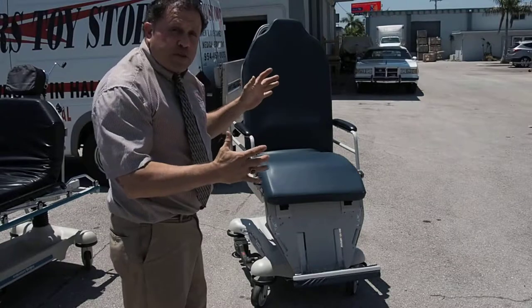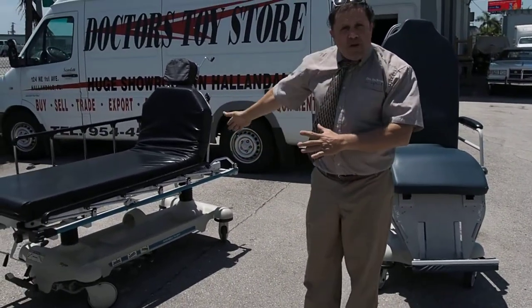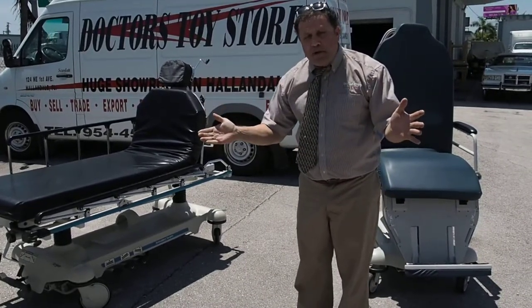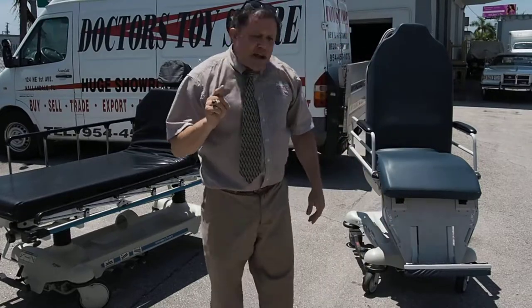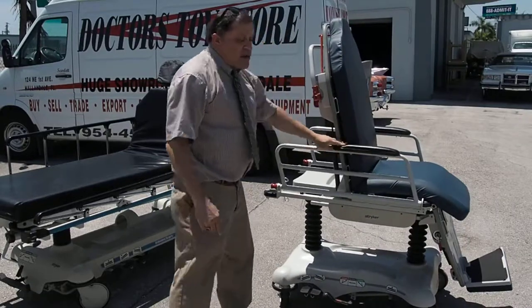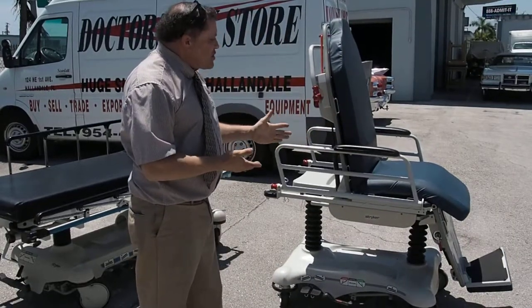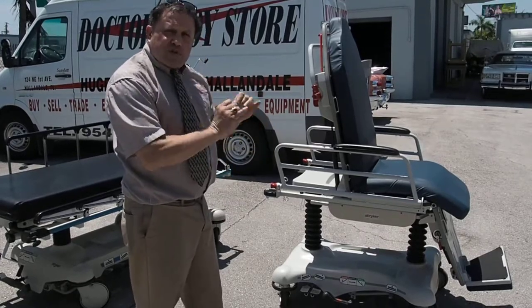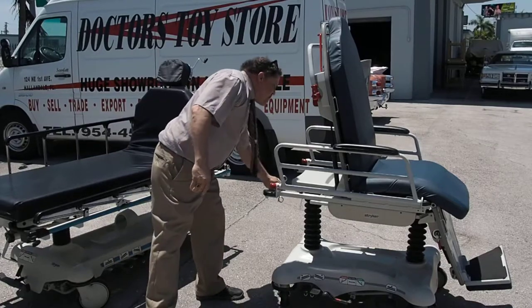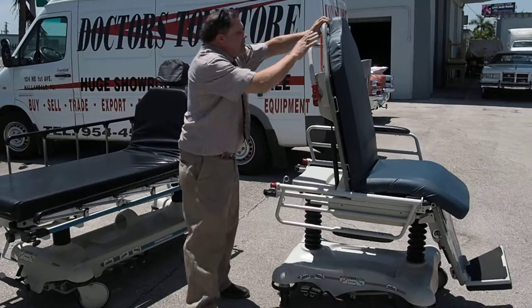Most people are limited for space. A regular stretcher is going to take a lot of space. We have them, and there are all different types of stretchers at the Doctor's Toy Store. Just call for whichever one you want. But the Stryker stretcher chair will not only save time and money, but when you're done with the patient, they can roll them and the patient can stay right there for recovery. A lot of doctors do quick surgeries on a Stryker stretcher chair. Also, some of the tests with IV poles — they're very easy to work with.